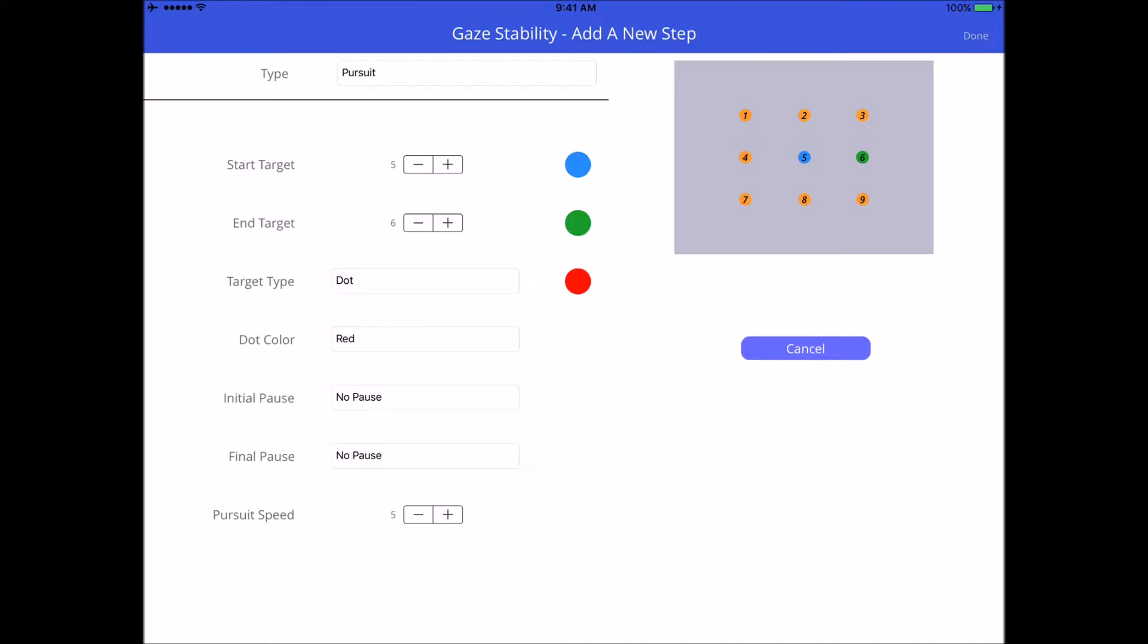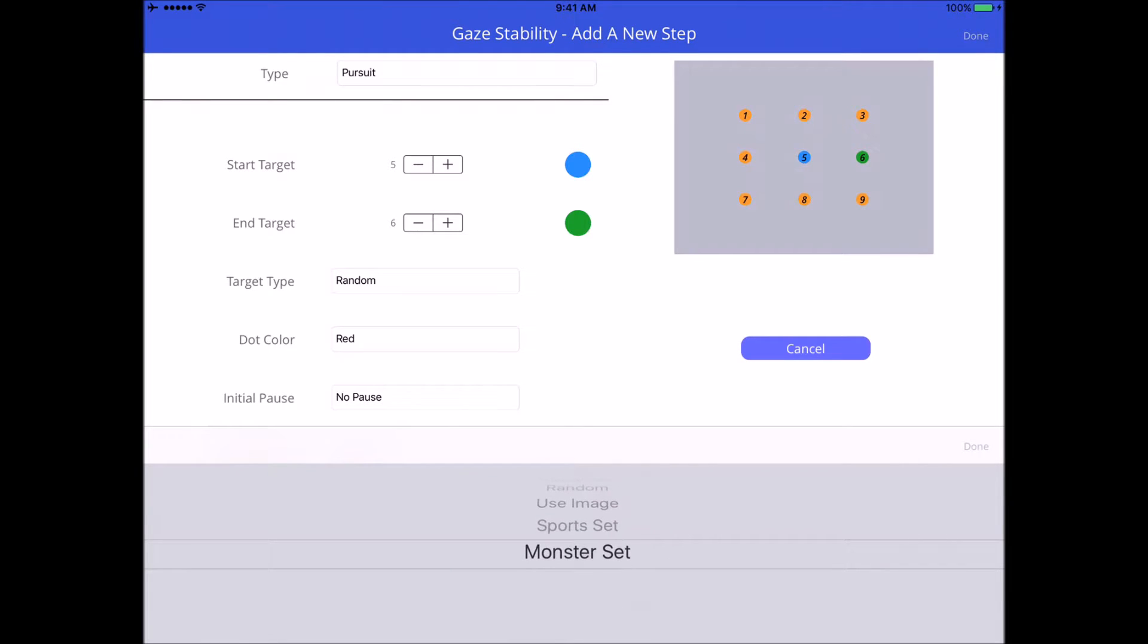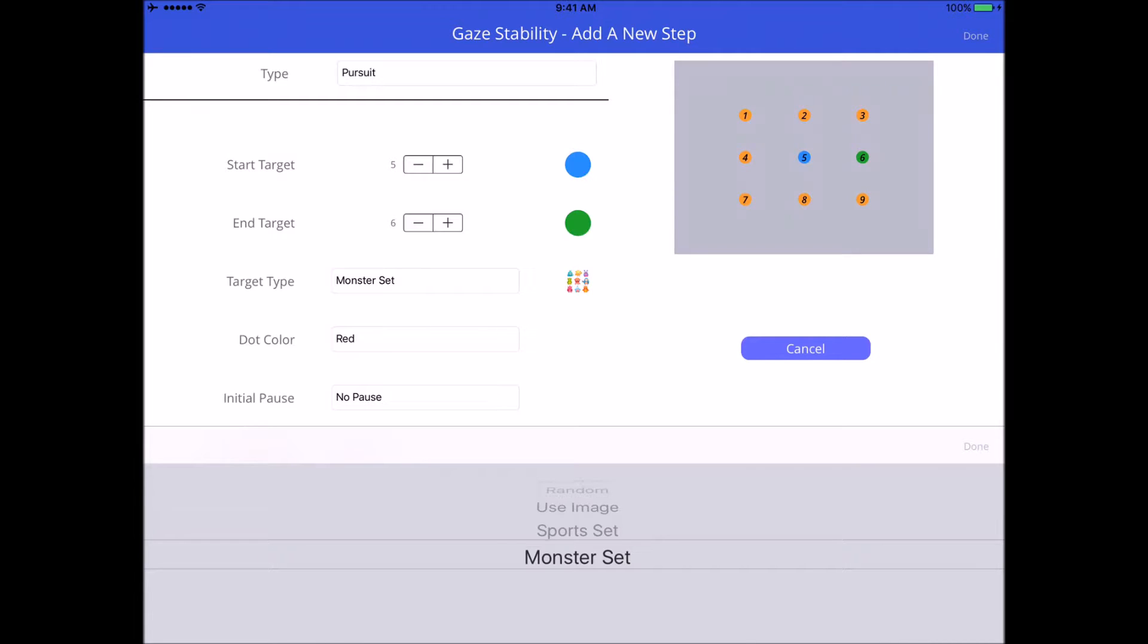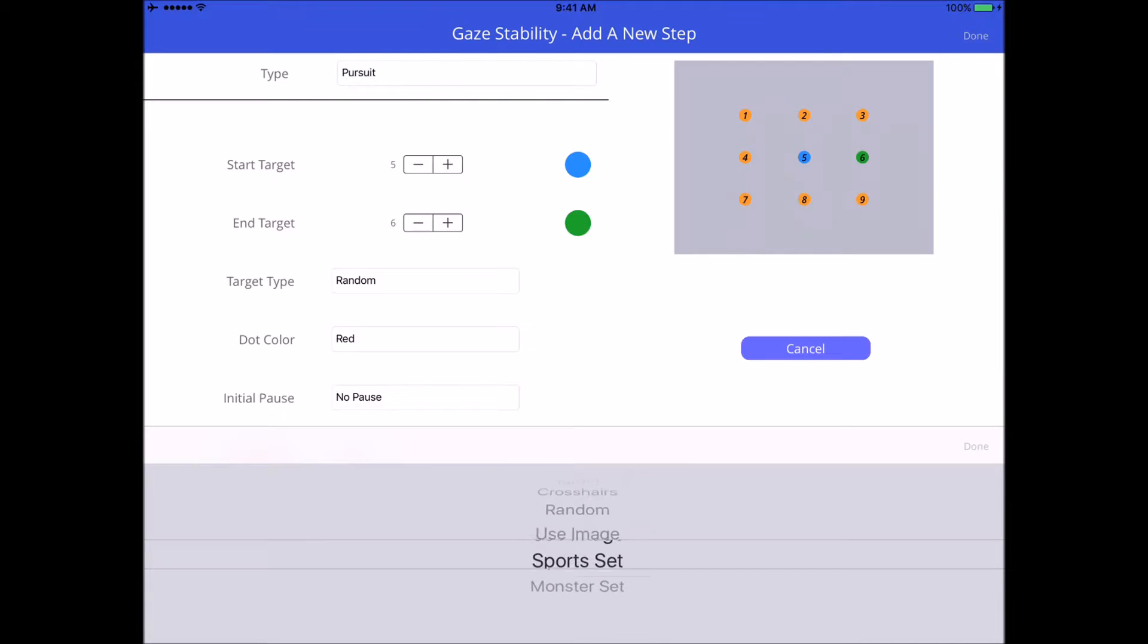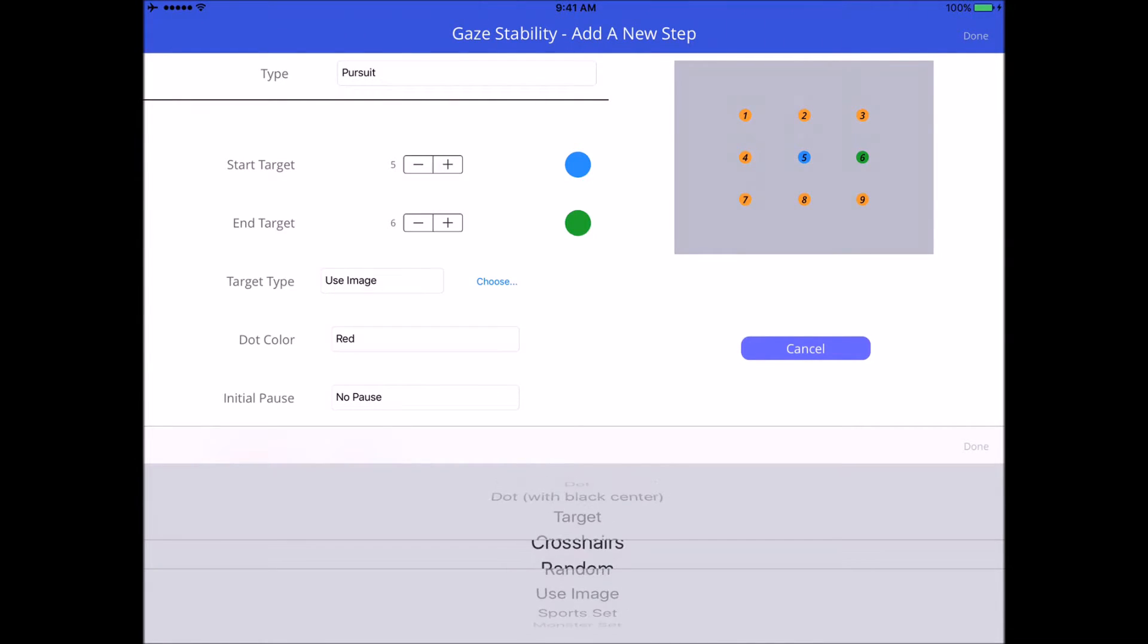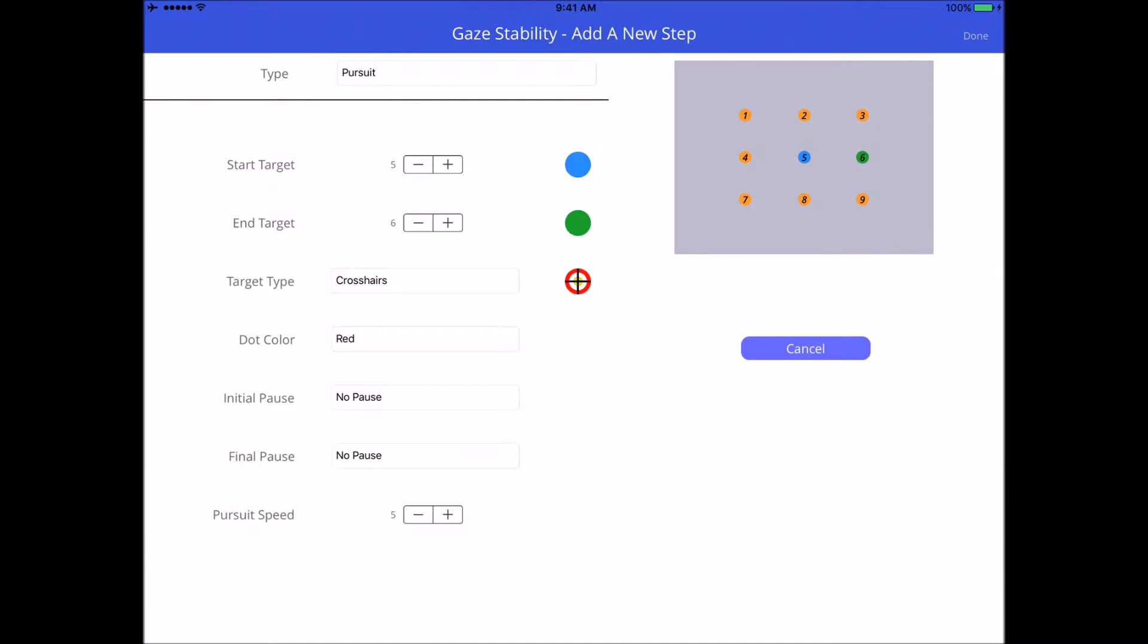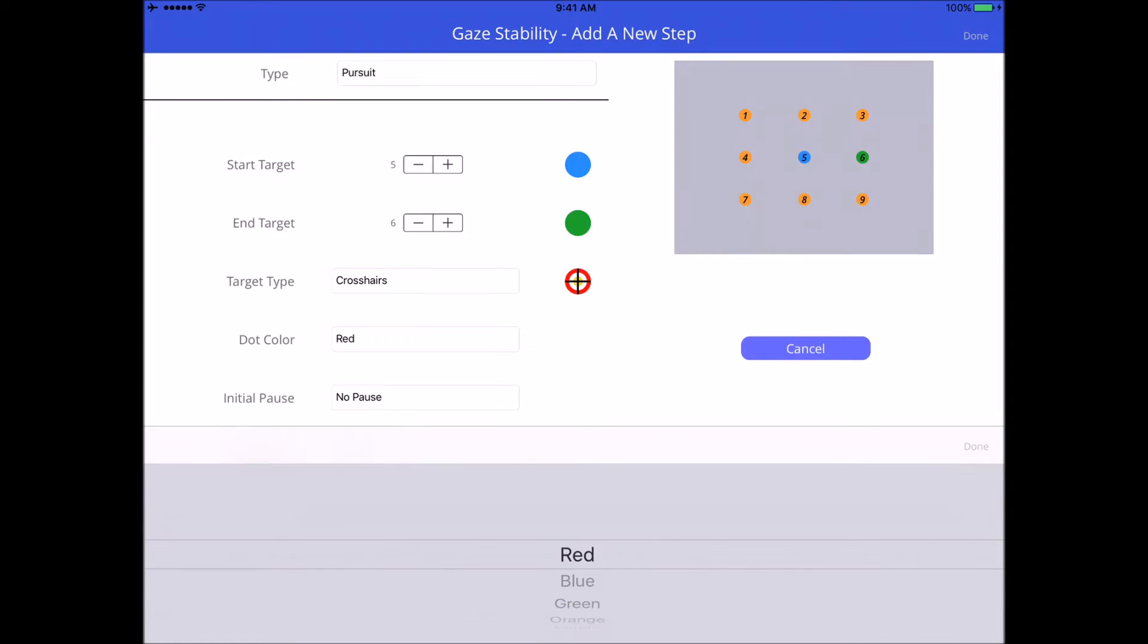Target type, you can pick anything you want. If you do monster set, the cool thing with that is the target will change from one to another, or sports set. You can load your own image right here. You can also use crosshairs. We'll just use that one, that's the one I personally use the most. Some people get tired if they do exercise a lot, they want to be entertained a little bit more, so we pick monsters or a funny picture or something like that.